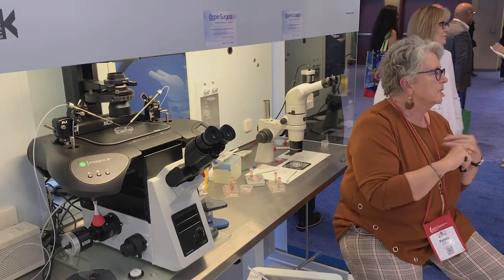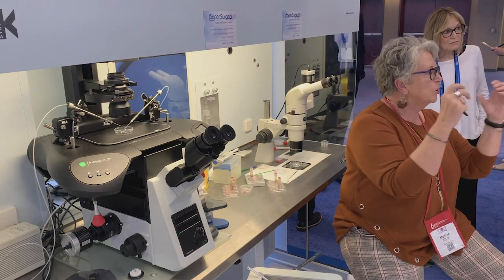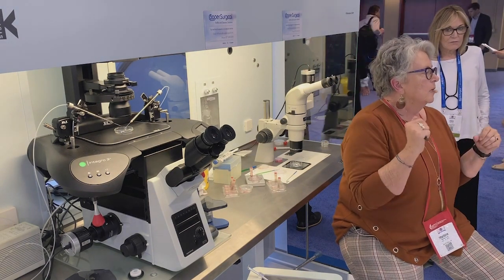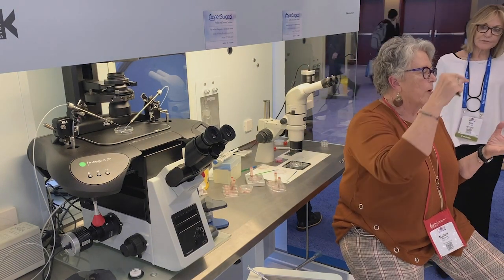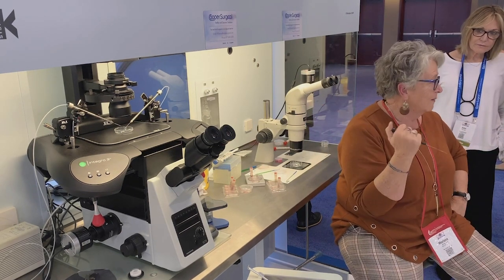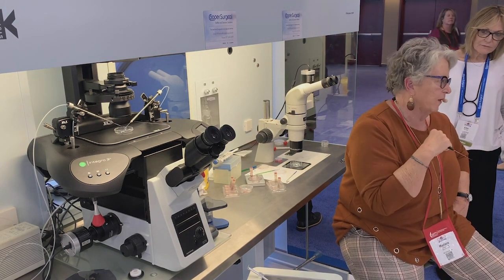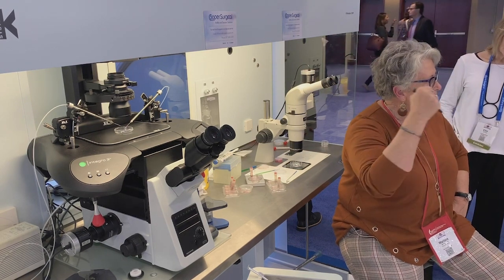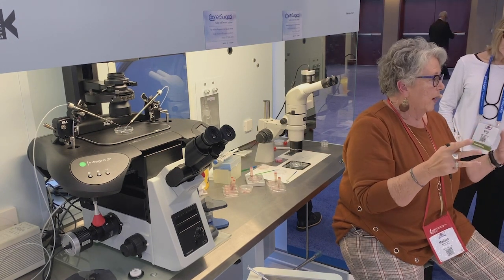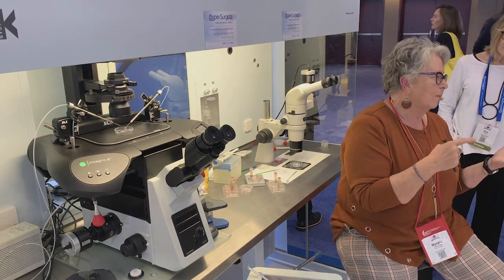All right, so the next question is, how much fluid do you put on your device? Do you put a big droplet, or do you put a little tiny droplet? Do you suck the fluid off once you put it down? Historically people have said you want to put the embryo on the device and suck your fluid out. I don't like that because of what you have to do to get the embryo off of the device. If you've sucked all the fluid up, it flattens out your embryo and it sticks really well, and sometimes too well. So the goal is to keep it on the device, but you also have to get it off the device.